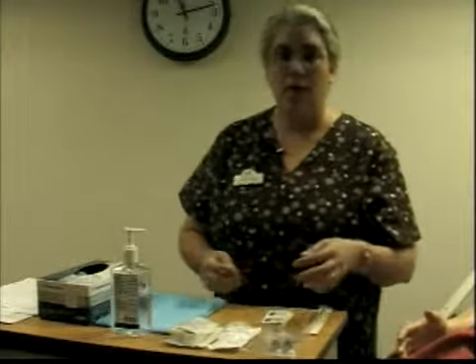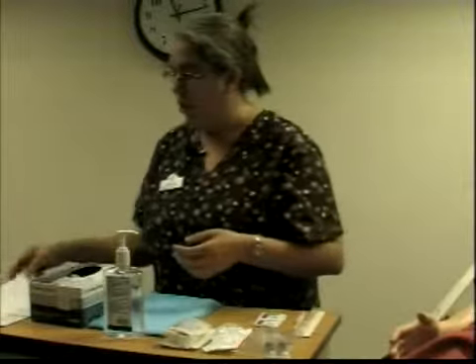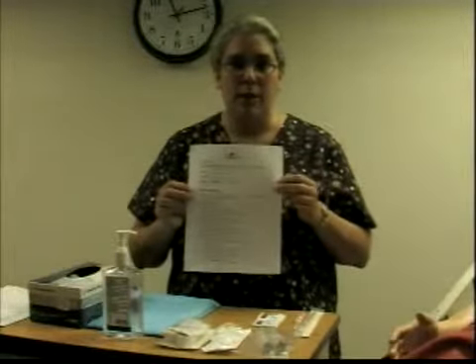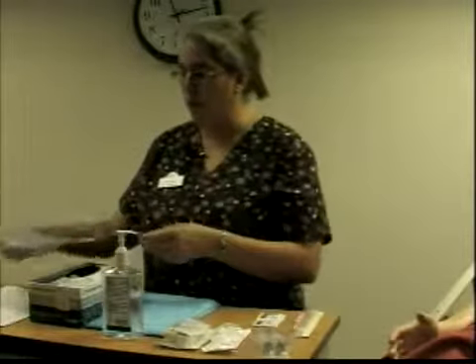Today we're going to learn how to start an IV, or insert an IV, on a client. You will have your student checklist and a WebCT that will give you step-by-step the important things that we'll be looking at as we perform this skill.